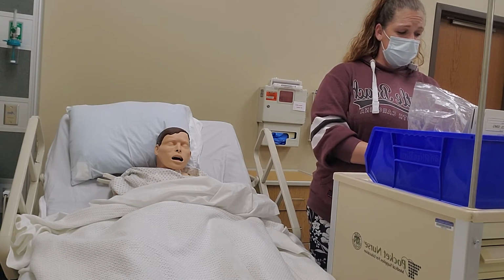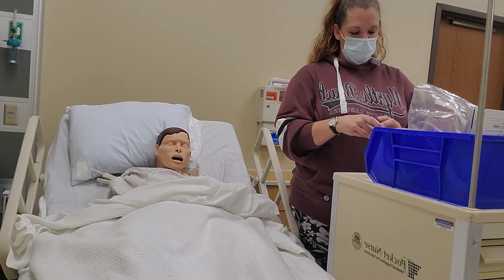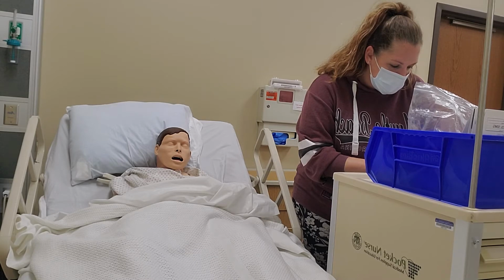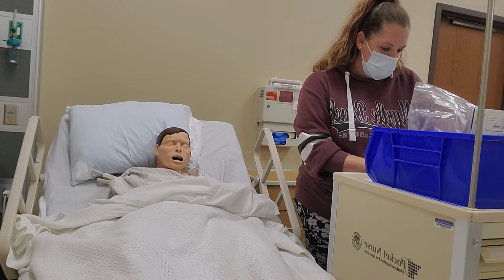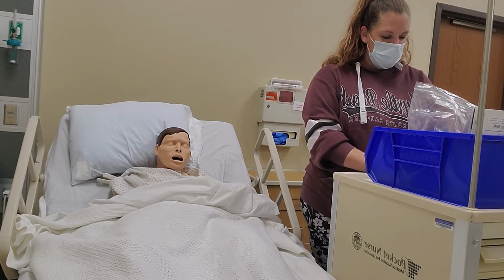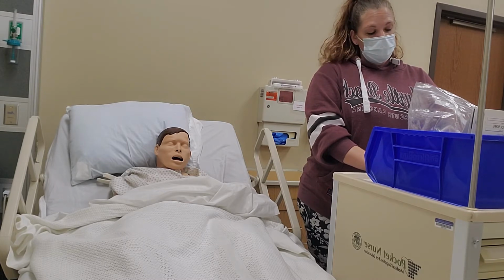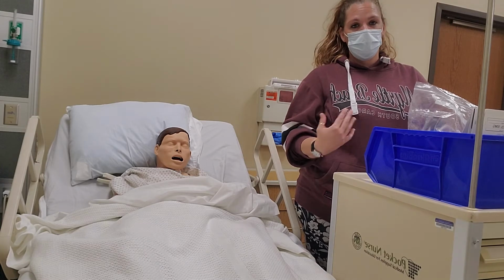And being that I have to draw up 2 insulins, I'm gonna do another check. Regular insulin. Units are, okay, and then the NPH I'm checking. 5 units, and then the expiration dates, they're not expired. You would get rid of these after 30 days. You find them in the fridge, and when you're not using them, put them back in the fridge.